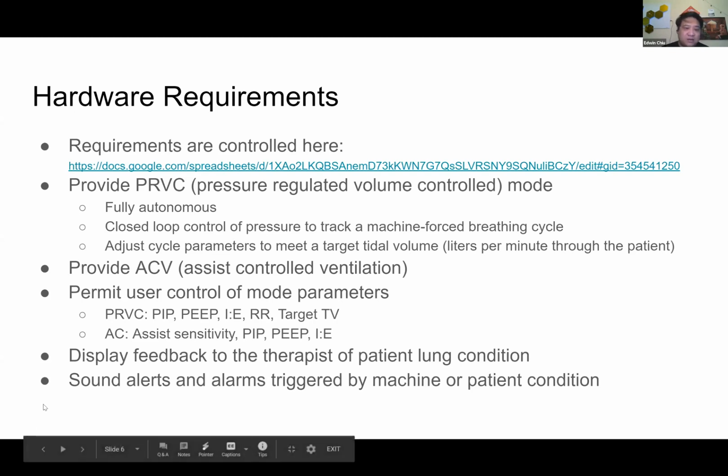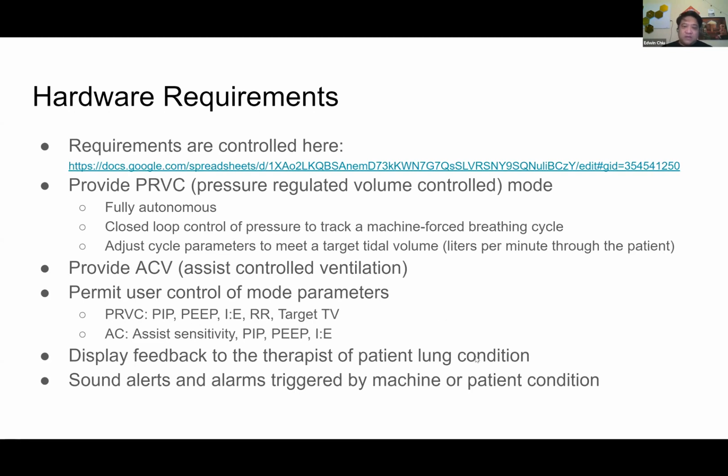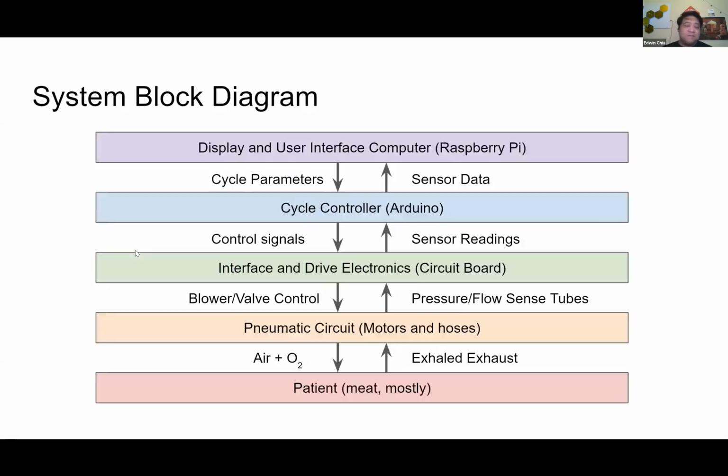And then finally, the system must sound alarms and display alerts based on either failures in the machine or changes to the patient's condition. All of these requirements are broken down into specific measurable tasks in the doc that is linked here at the top of the slide.